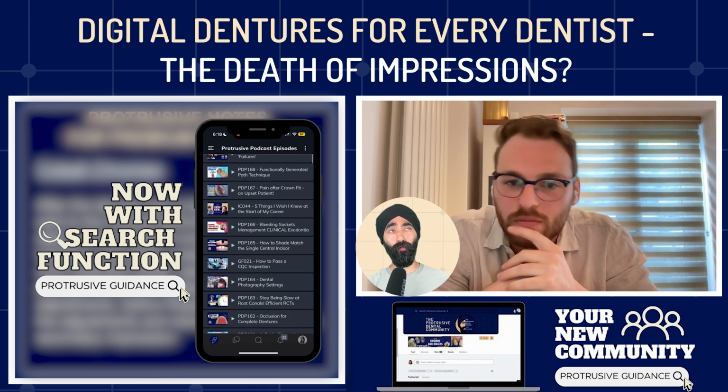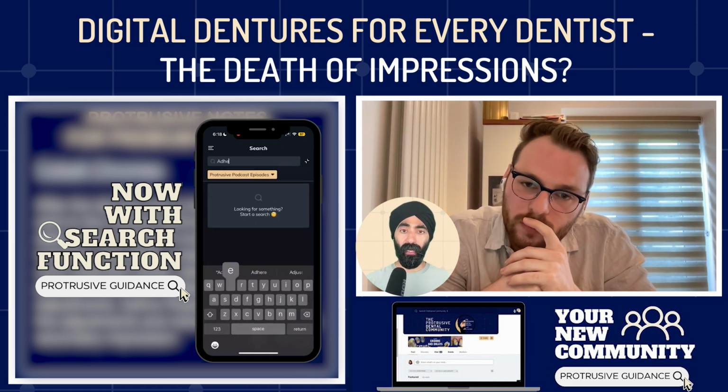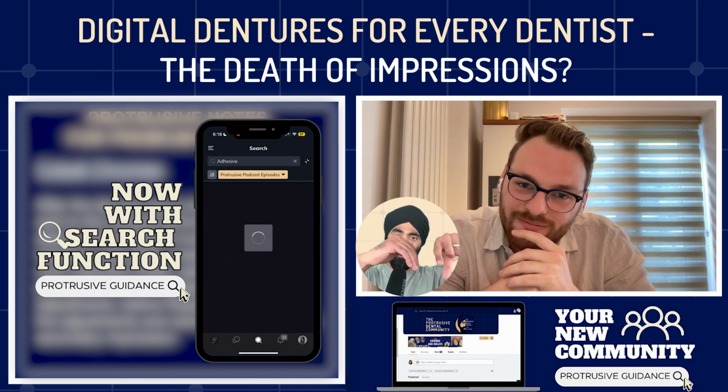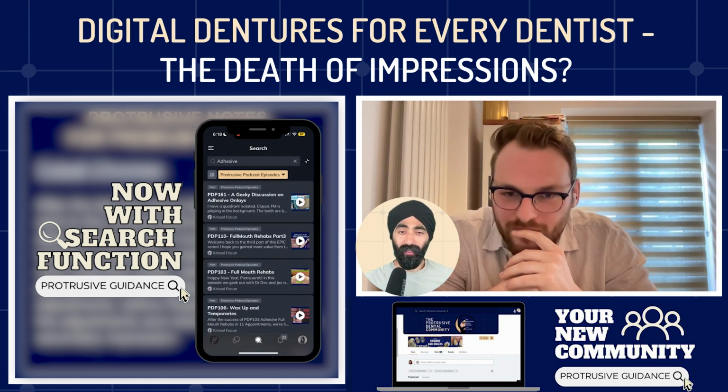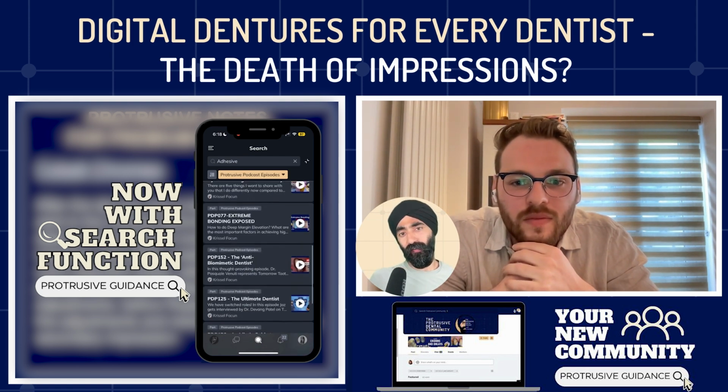Now, just to talk more nuances of this bit, I quite like nowadays, if I'm doing the guide planes, I get my technician to make me these acrylic copings that just guide me exactly where to drill. I quite like doing that. Do you eyeball it? Do you ask for copings? How do you get the guide planes perfect?